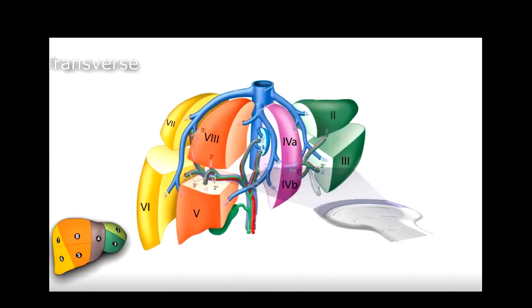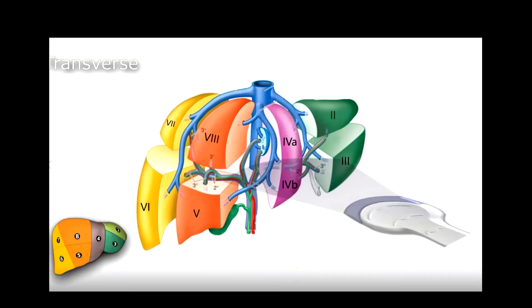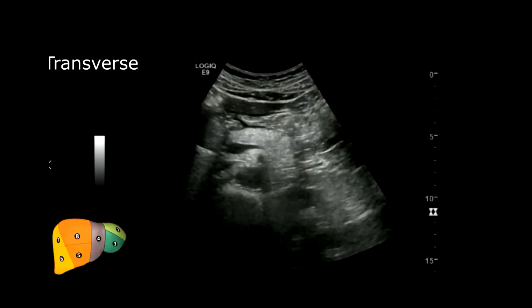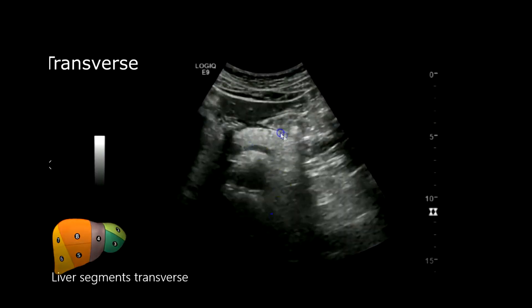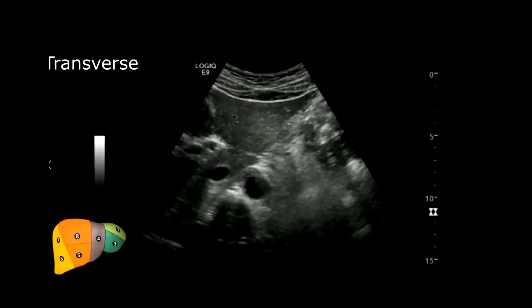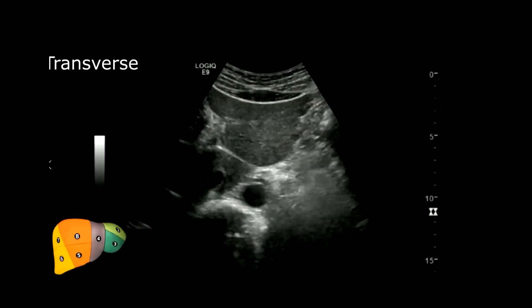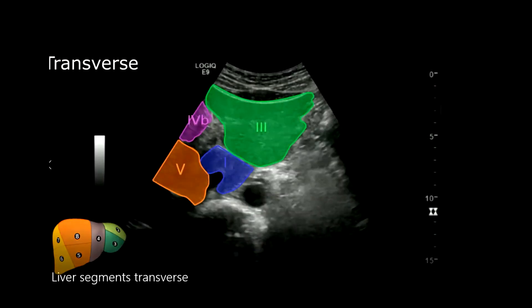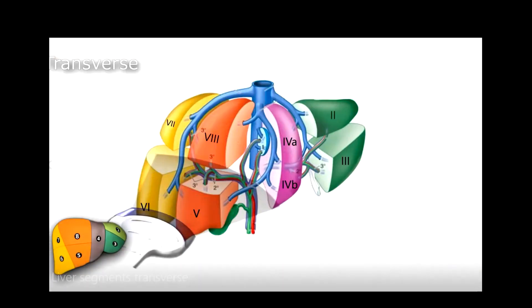Now approaching from inferior to superior, you can see the pancreas. Angling upwards, here we have segment 3, caudate lobe, segment 5, and 4b — so we're around this region right here.